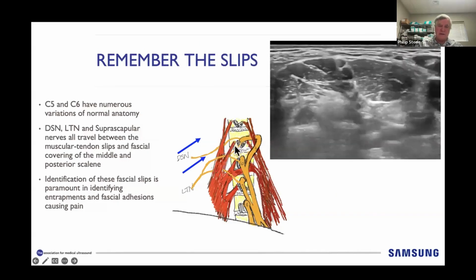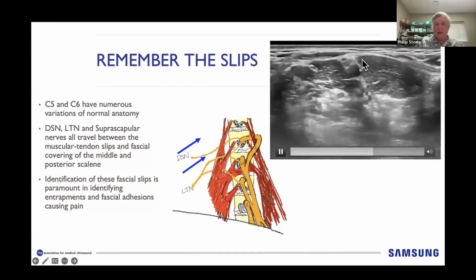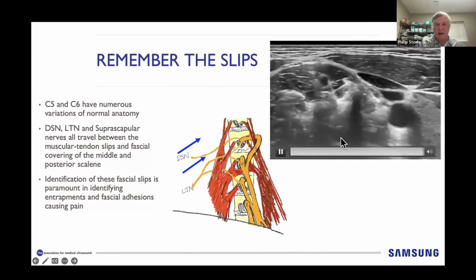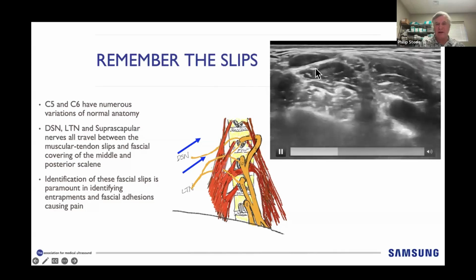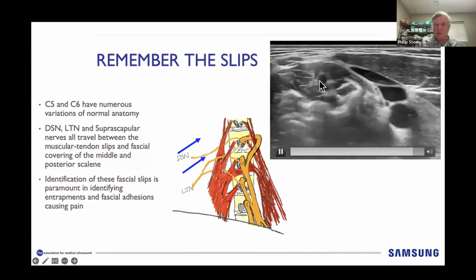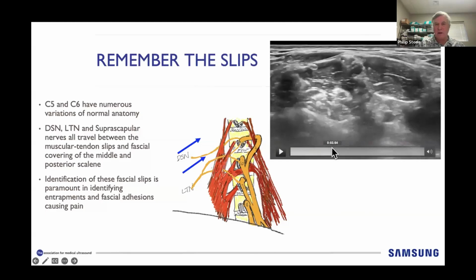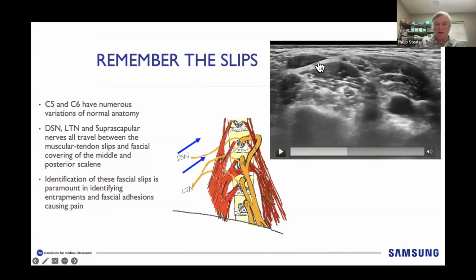Okay, again, this is this crude drawing I have, but the nerves are going to travel through these fascial planes. And the easiest ones to identify are 5 and 6. 7 can be problematic because it's quite deep, but you can identify them. But again, here you see this fascial plane and everybody hanging out right here, which we'll show in the long thoracic nerve study. Here's the 5 contribution here. So I'll show that again. So this is all long thoracic nerve. And then you see somebody leave late. And I'll talk about this in a minute.